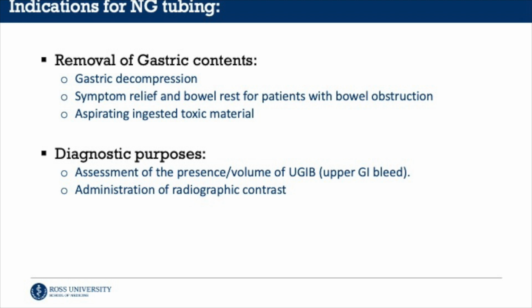Another great indication for NG tubing is of course for diagnostic purposes, perhaps for the assessment of the presence and the volume of an upper GI bleed in a patient, or for administration of radiographic contrast for radiographic imaging studies.